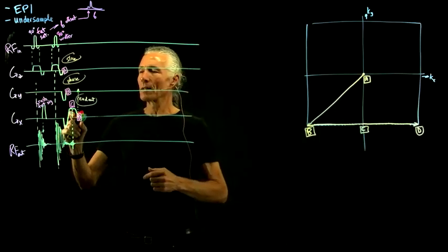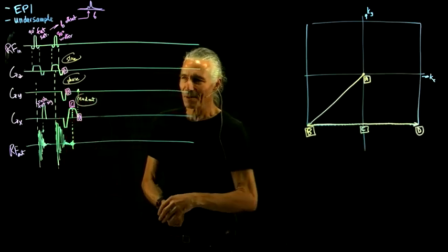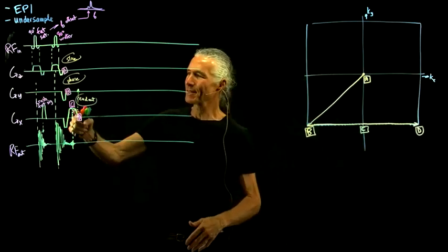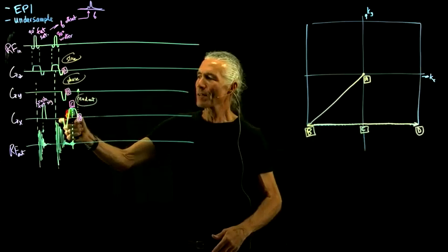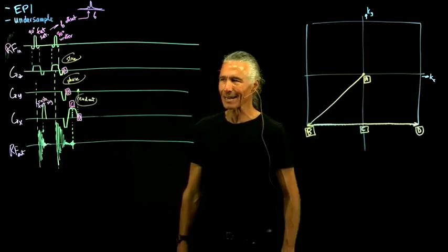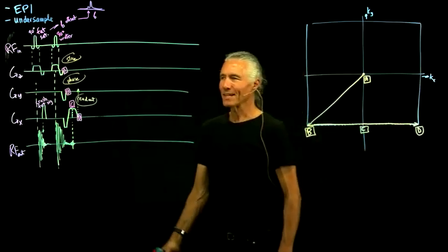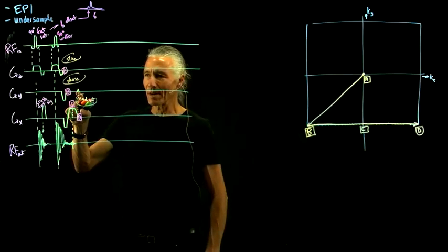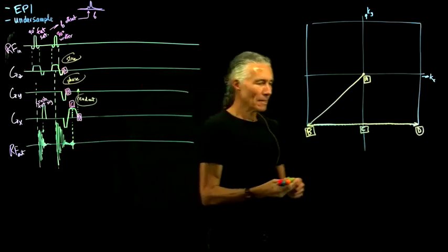We'll take a trip over to the MRI center and turn on the magnet so you can hear some of these things. If you turn that gradient off and just listen to the blips, they're just little tiny sounds because it's not much of a gradient. But it's a positive gradient, and so what does that do?